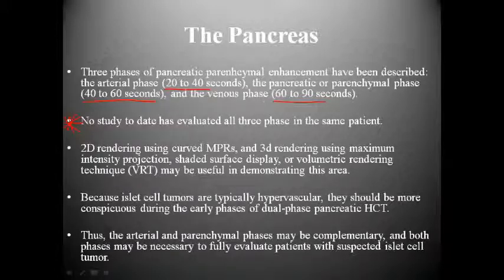2D rendering using curved MPRs and 3D rendering using maximum intensity.